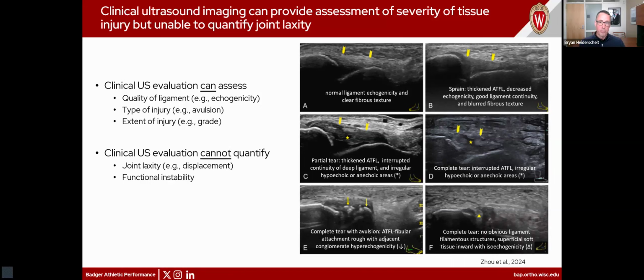But does that give us enough resolution or precision to gauge how this patient will do long term, and whether they will be successful in hopefully preventing some of the AI or CAI, the chronic ankle instability features that so commonly present themselves? Also, what is the likelihood of a re-injury, and maybe that laxity and the extent of laxity is one of the predictors of these re-injury risks that we're concerned with.